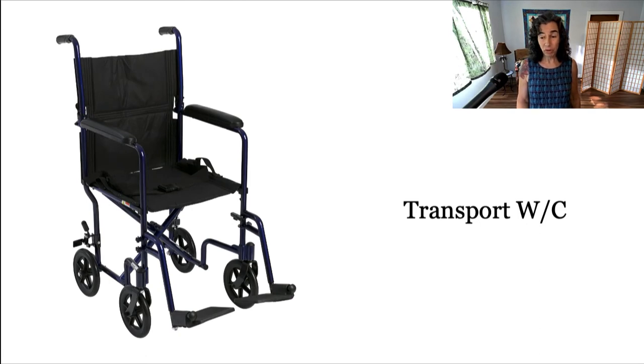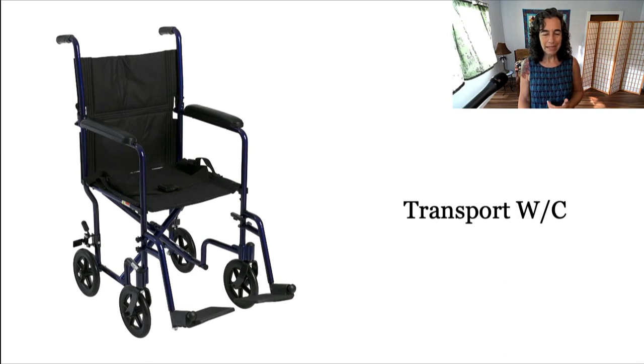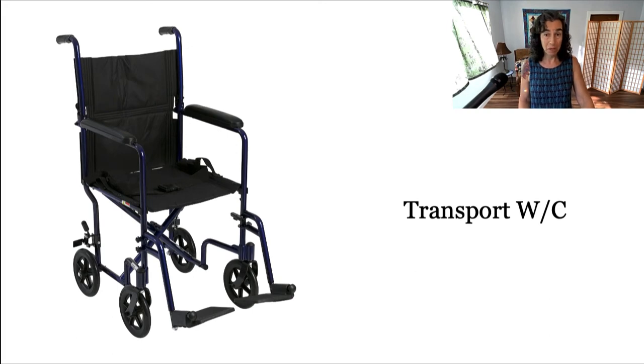This is a transport wheelchair. It is for clients who can't self-propel themselves. It's used in hospitals and airports. You might have seen it, somebody pushing a wheelchair through the airport. It's less expensive, doesn't give much support, not really customizable, and we don't usually order them, but we want to be familiar with them and that they exist. And notice also that there's a seat belt. So seat belts in chairs are another option.